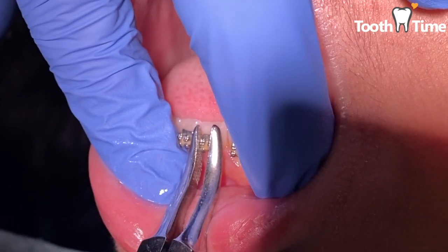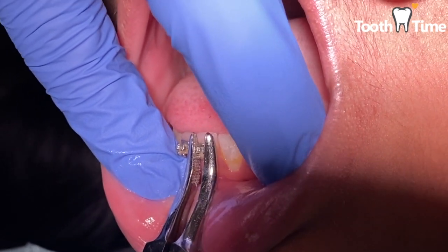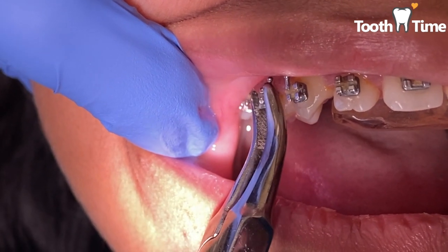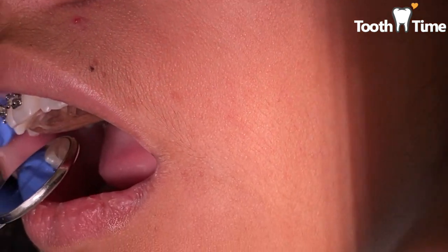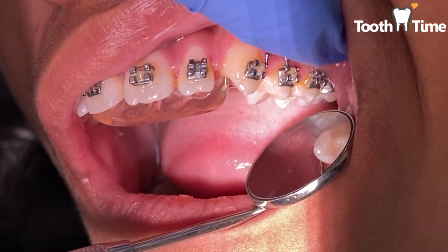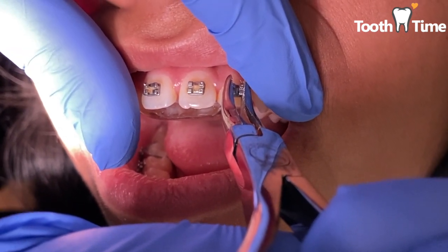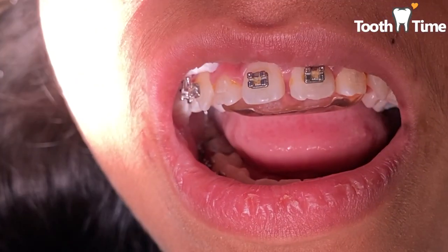And in this appointment, this patient needed 7 brackets removed to reposition the teeth. What we do first is we go ahead and we remove the glue from the teeth.